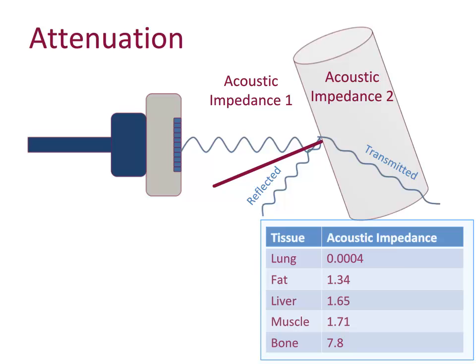But it's not only the boundaries between tissues that reflect sound. Since body tissues are not perfectly homogeneous because of fibrous tissue and blood vessels, tissues do not have a uniform structure within them, making them appear in different shades of gray. The standard or generic tissue in the body, the tissue that is used for reference, happens to be the liver, namely the non-cirrhotic liver, because cirrhosis makes the liver look more white, or more echogenic than normal liver.